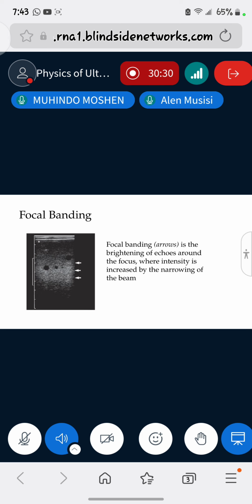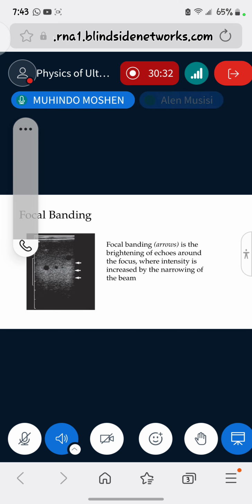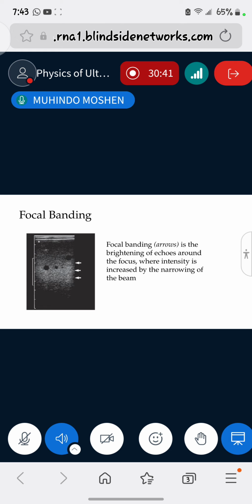Excuse me, sir. Yes. I request that you recap for me about spatial compounding, how spatial compounding helps in controlling or preventing these artifacts.